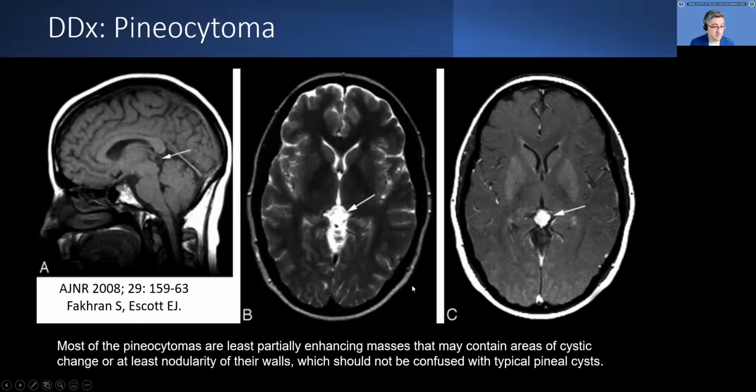So my conclusion is, if you do a contrast enhanced MRI, and it's a simple cyst and there are no symptoms, the patient may be just sent home and told that if you have any symptoms, come back. But otherwise, there may be a maximum 1-year follow-up. Then if everything is fine, the patient may not need any follow-up MRIs again.